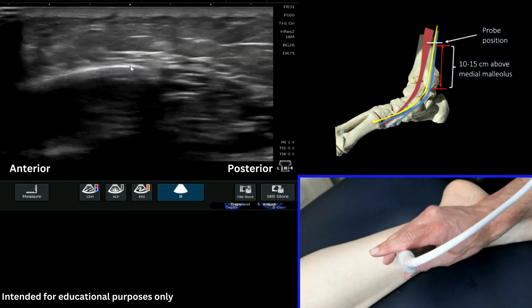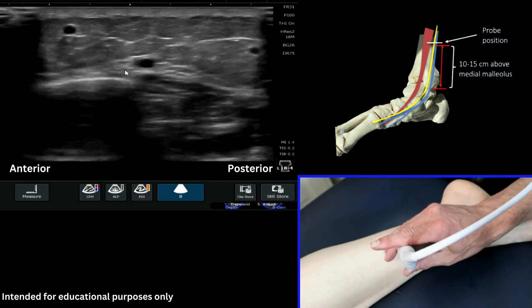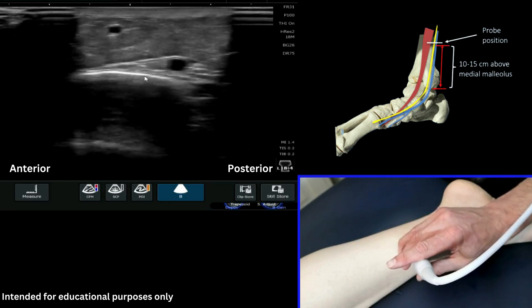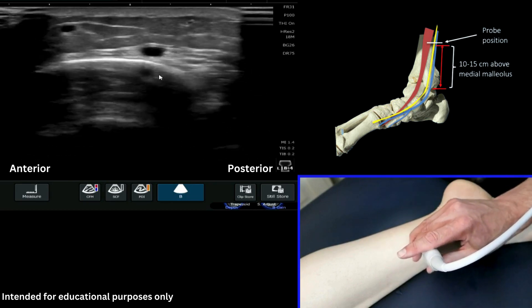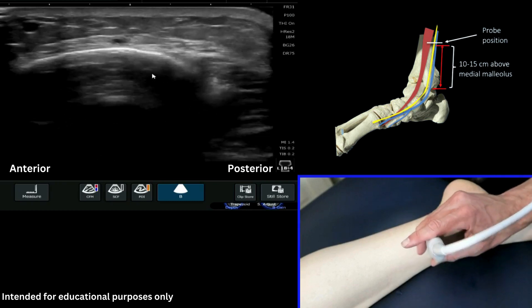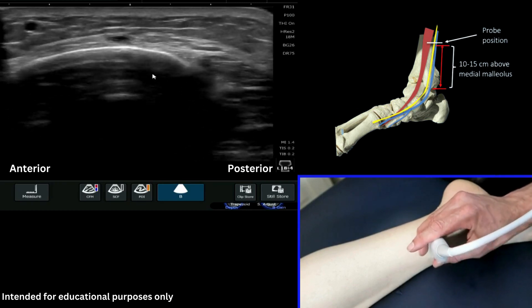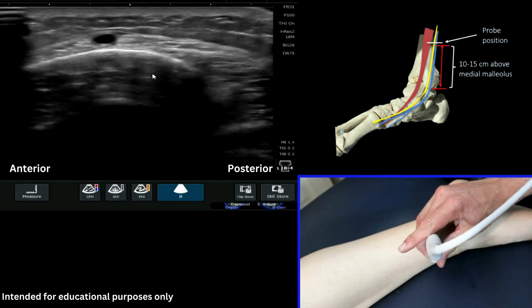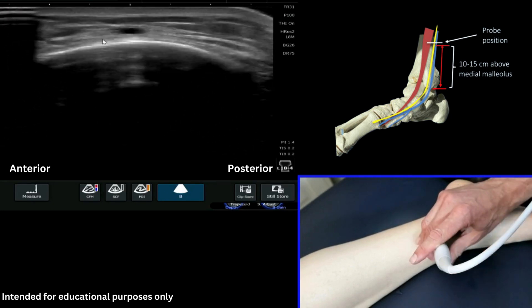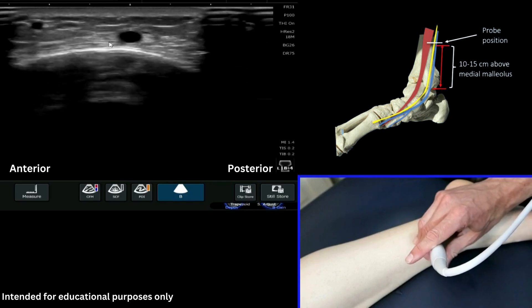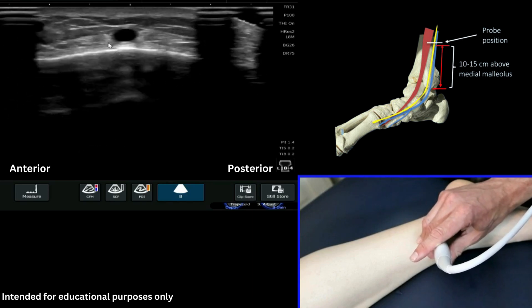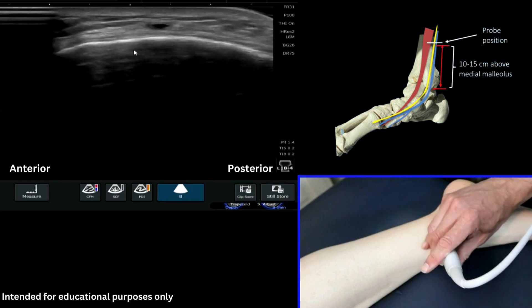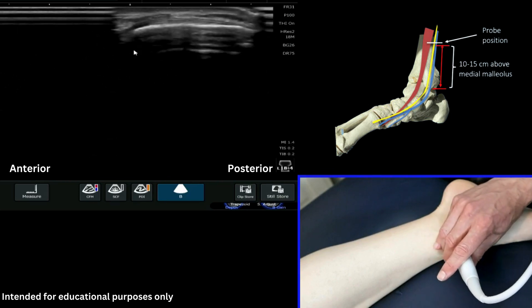Pop back on again — we've now got the tibia here again, there's our vein, here's our nerve. As we keep coming down you start to see that actually it sits almost on top of the medial malleolus at this point. If you see my probe position here, I'm just now on the malleolus — there's the vein and here's the nerve just sitting anterior.